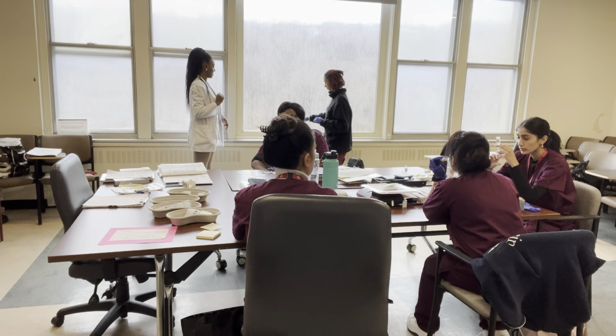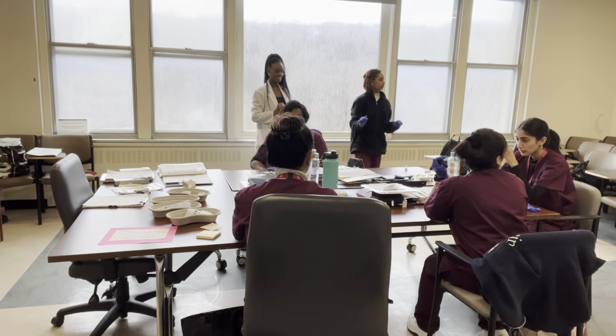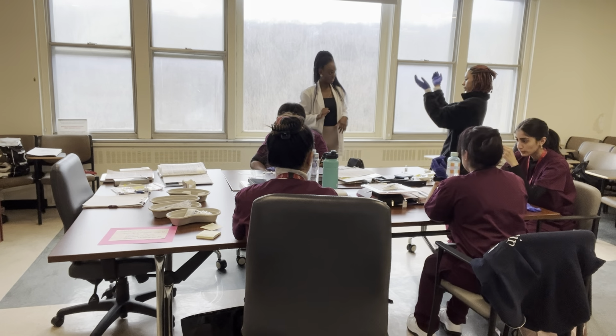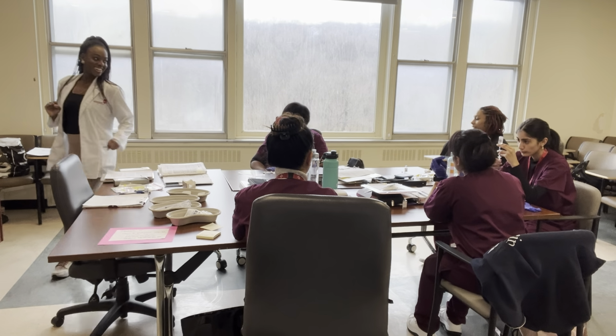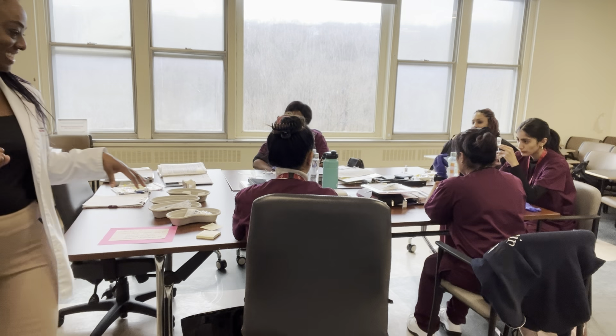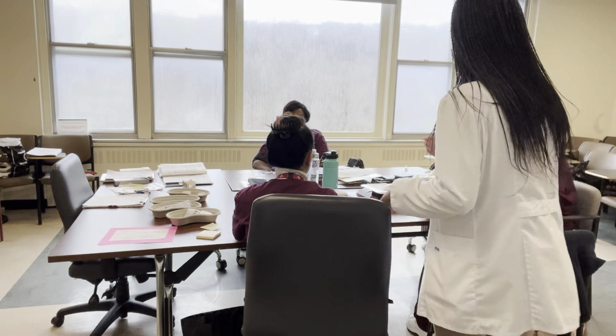Good. Perfect. Don't worry. You got it. And then what do you do? Come back to your patient. You never check for any bleeding. So you also forgot your 2x2. Okay, so you'll redo the process after. Okay, so I will do yours.